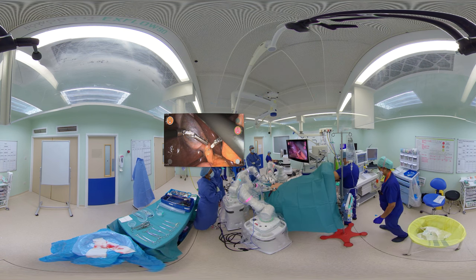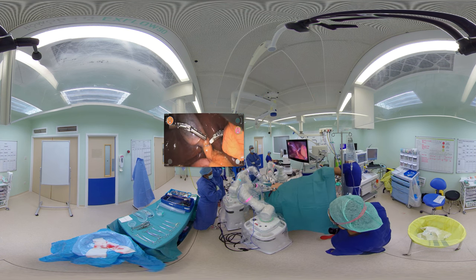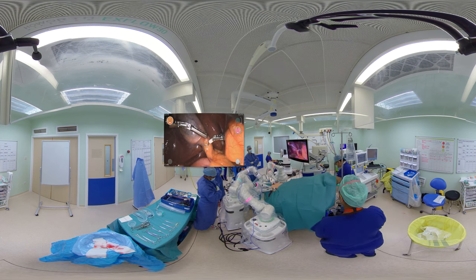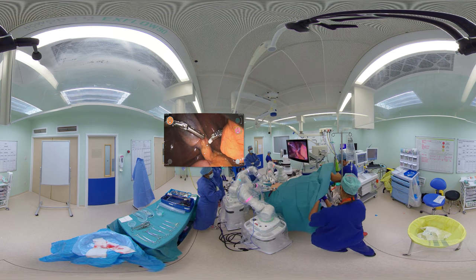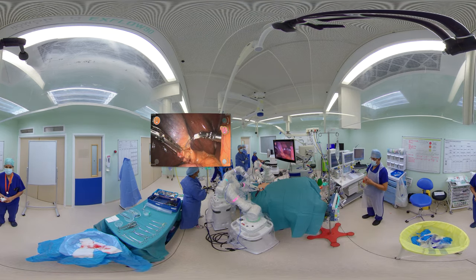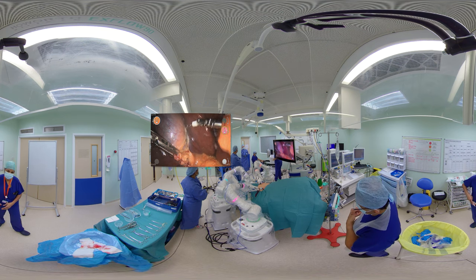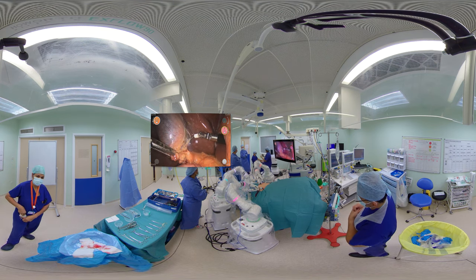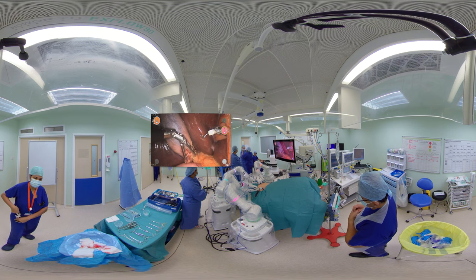The operation begins with division of the peritoneum on both the medial and the lateral aspects of the gallbladder. This allows dissection of the Calot's triangle and identification of the cystic duct and artery. The 3D view and the fine movements of the robot allow a very clean dissection.